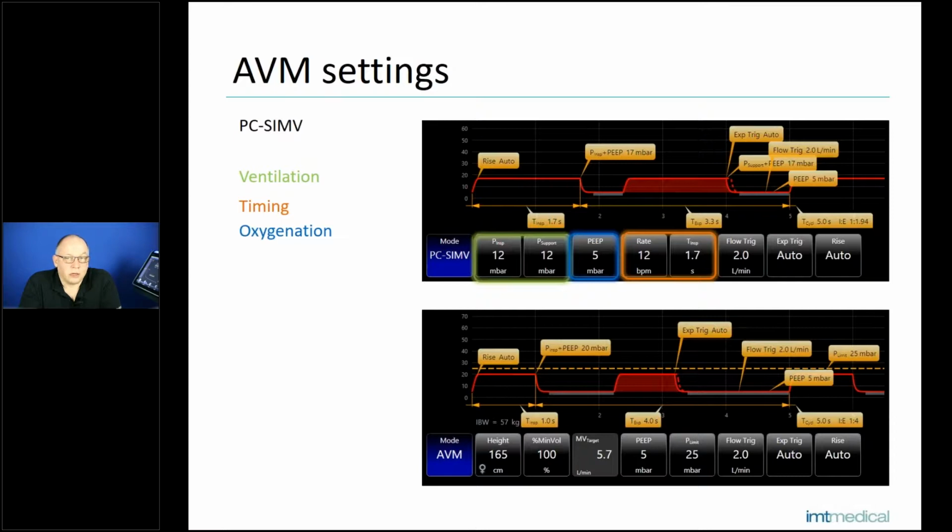Okay, now we'll change to bellavista and demonstrate how to set up bellavista and how to work with AVM and what happens if we change settings, for example. So we go to the demo.